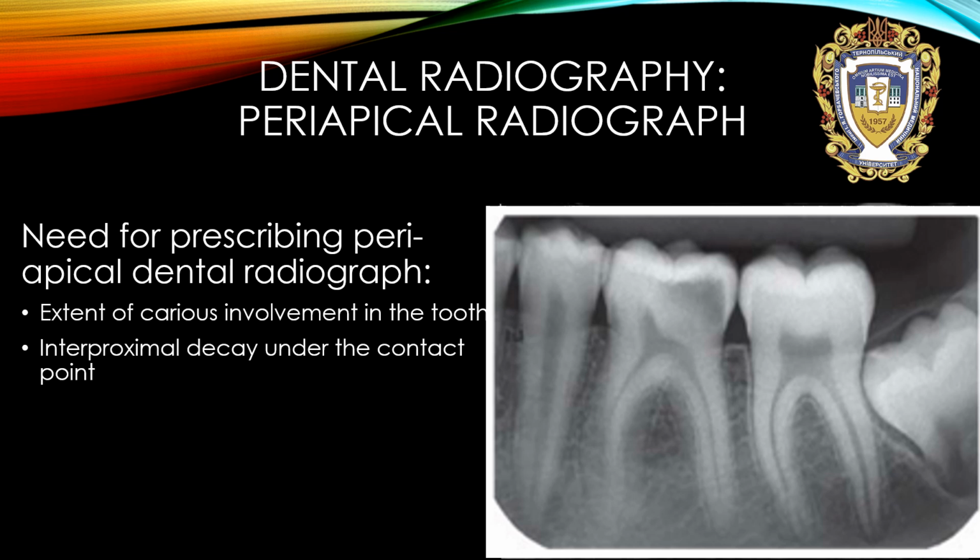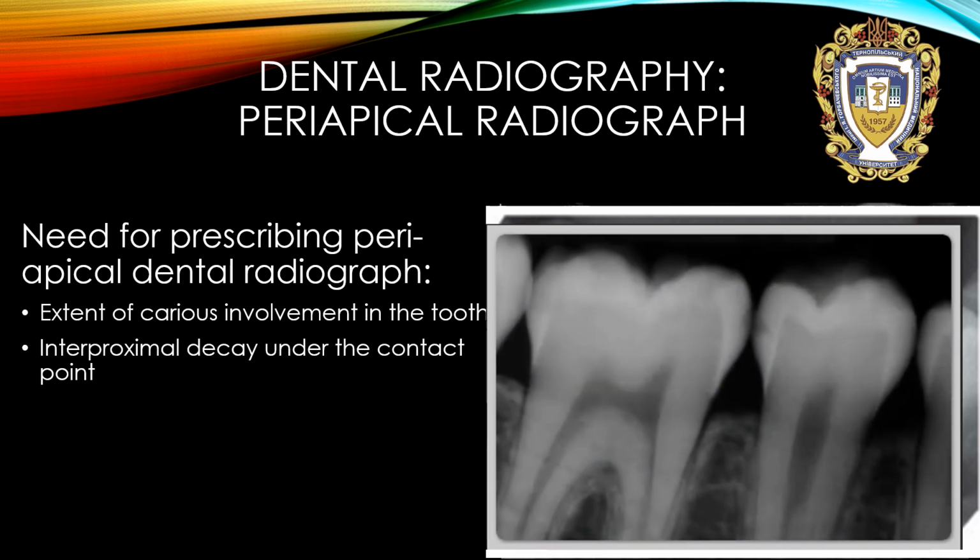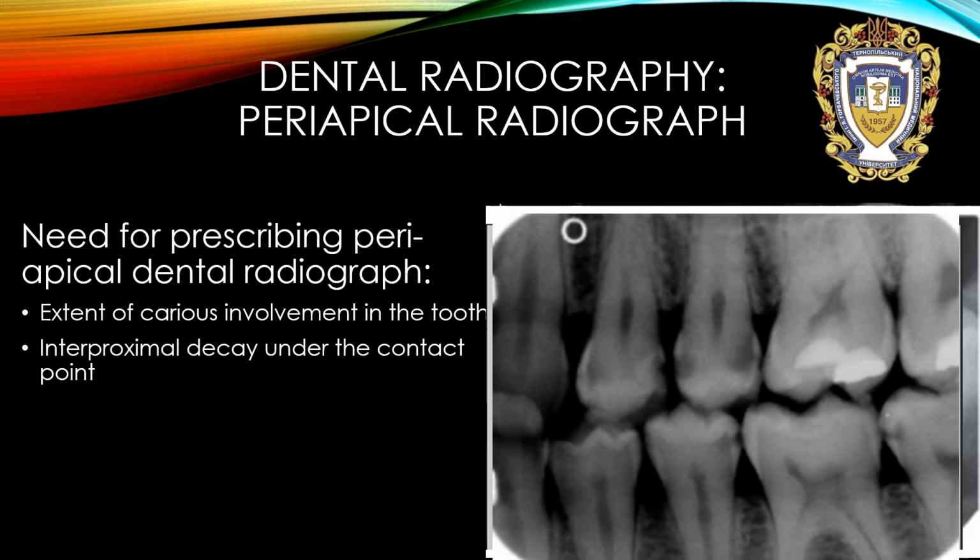Interproximal decay under the contact point. Please, colleagues, be very attentive. These kinds of caries are not visible intraorally, but we need to pay attention to the interproximal surfaces to notice it in time. Next situation, multiple interproximal decay.